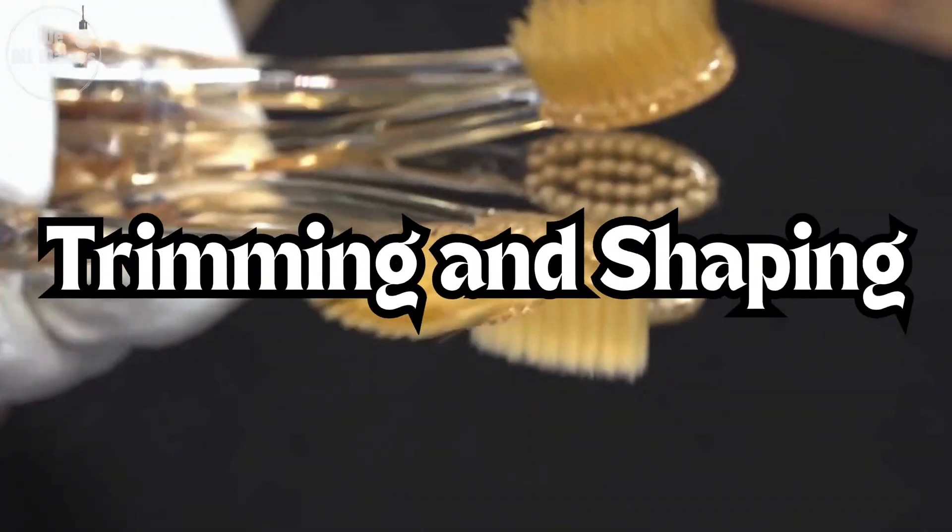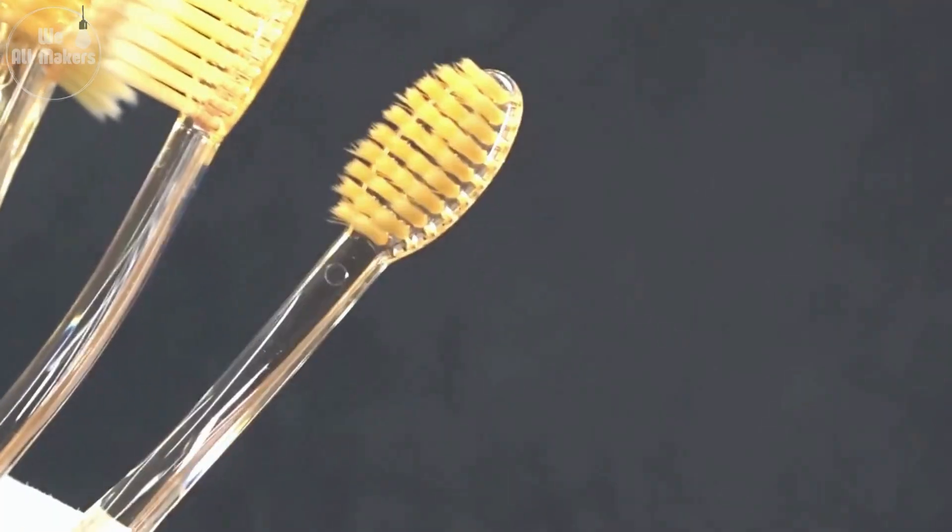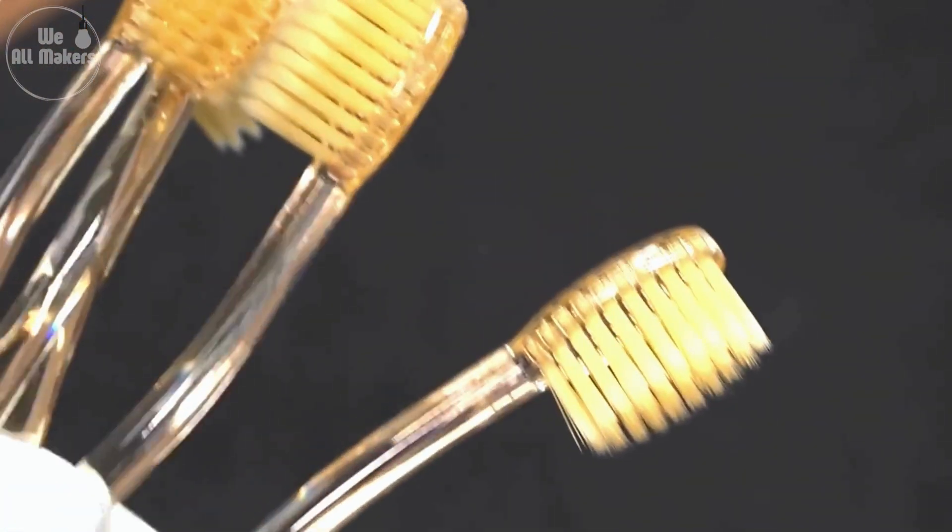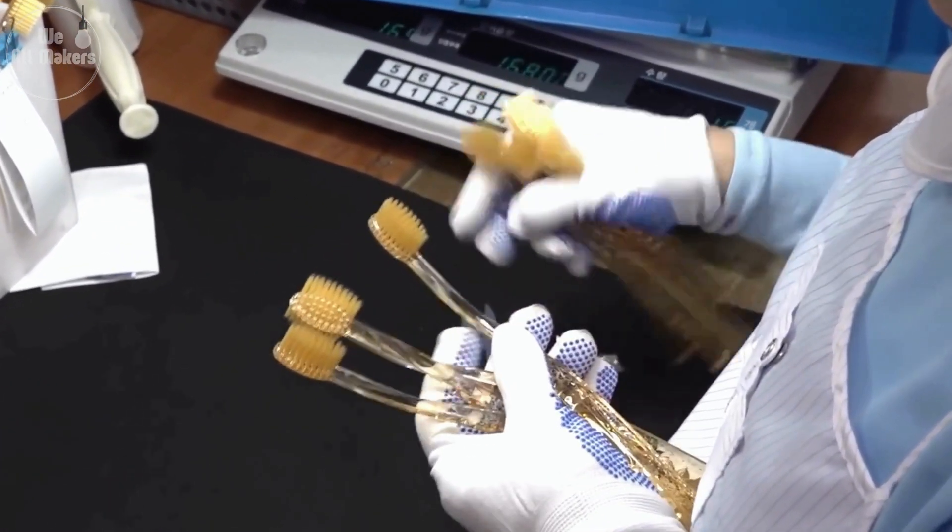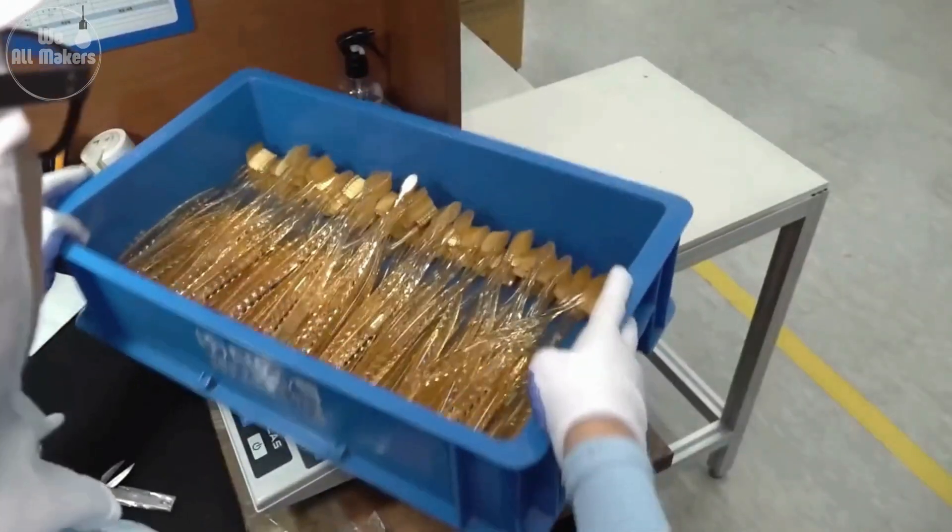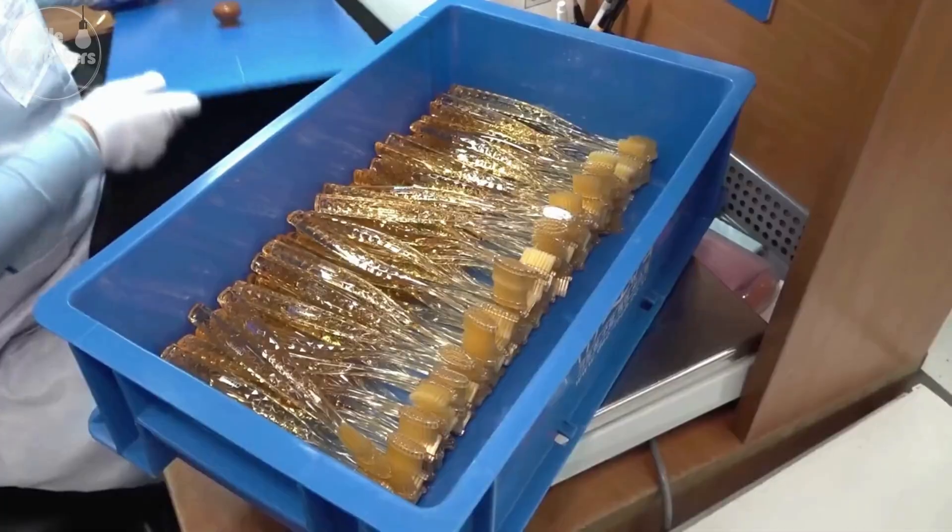Step 5: Trimming and shaping. Once the bristles are in place, they're trimmed to the right length and sometimes shaped into specific patterns. This step is all about making sure the toothbrush can reach every corner of your mouth effectively. Whether it's a wave shape or a dome, the design helps you get that perfect clean.